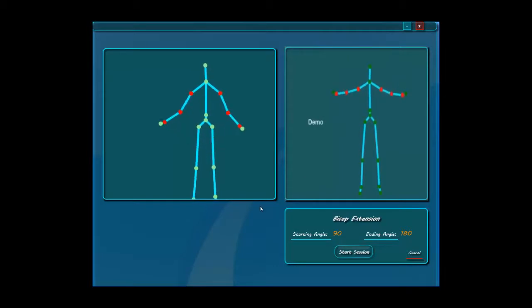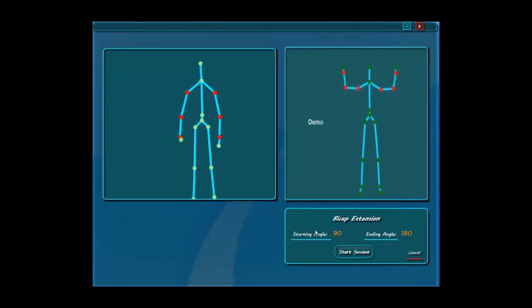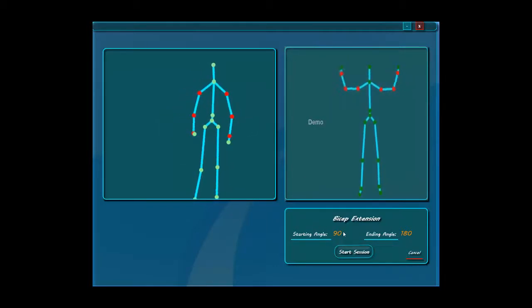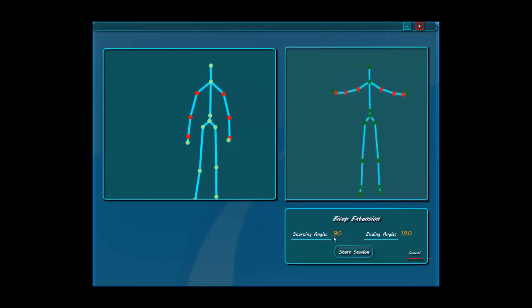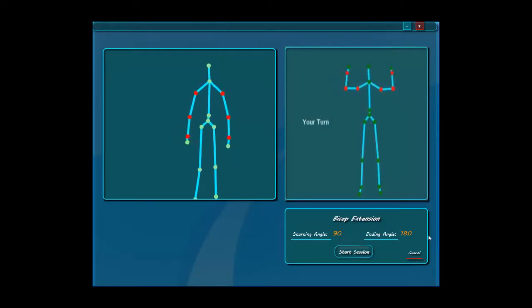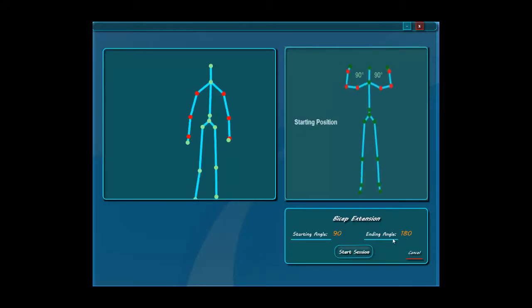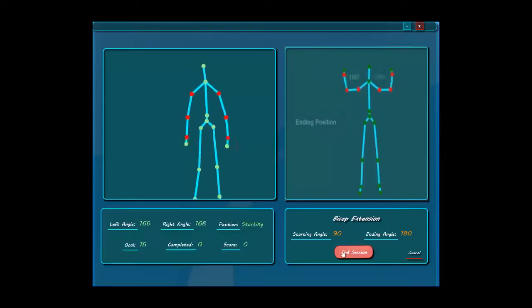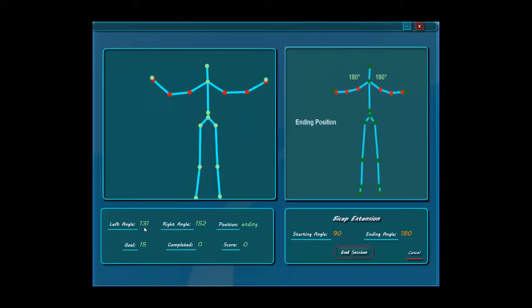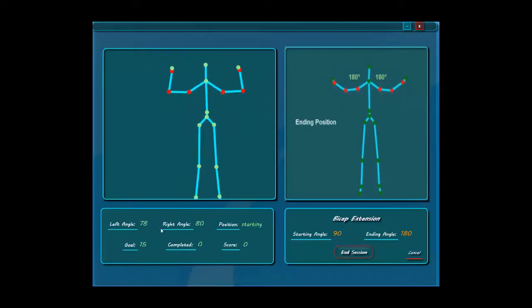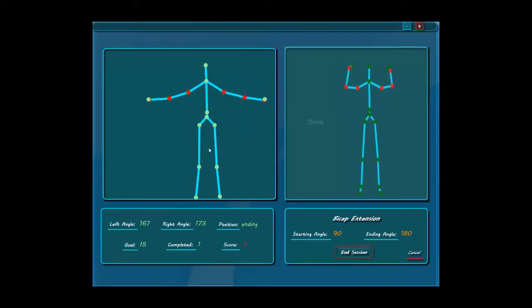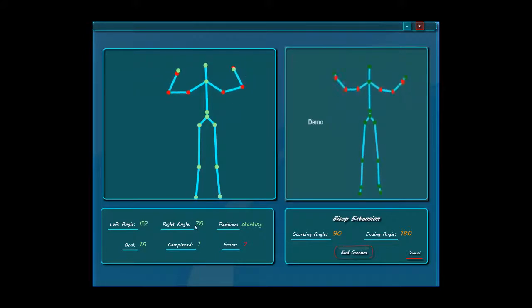The application will track your session if you're doing it right or wrong. Right here you see the particular angles the doctor has assigned to you, because depending on your condition you might have different angles and different types of exercises. As the patient starts a session, he immediately sees feedback of the angles from the right and left arm — you can see the red dots — and the position he's currently in.